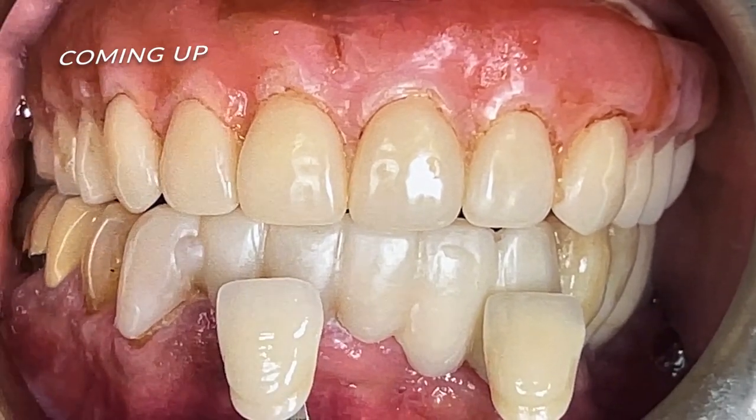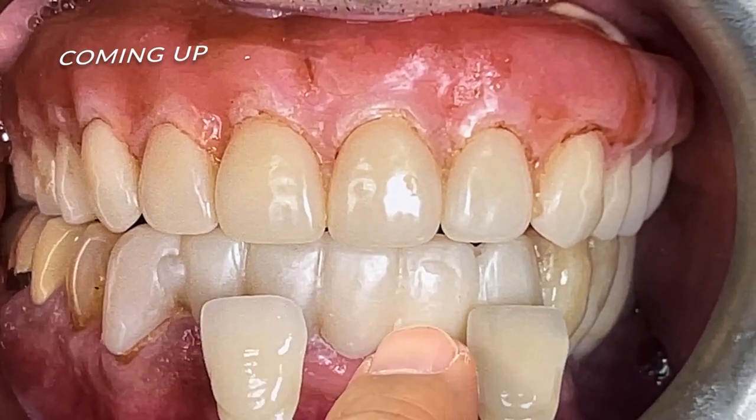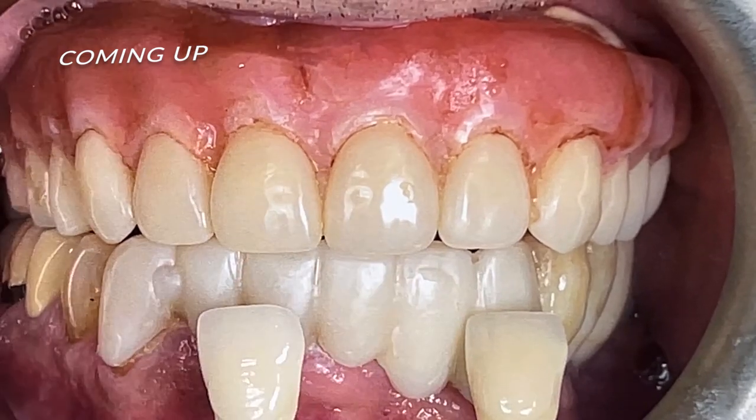The design was there. Looks like the lower is a temporary to me, so this is what we build it except.